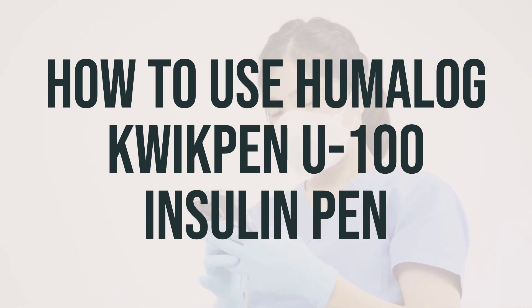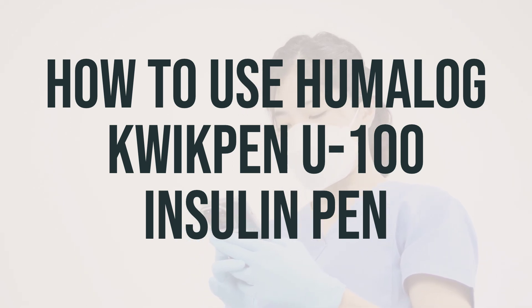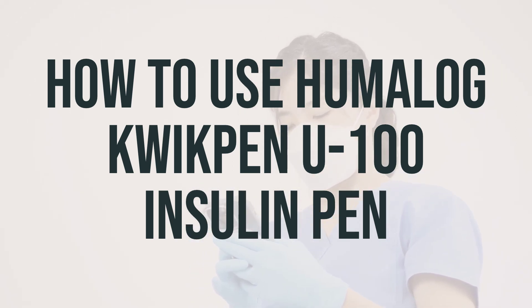Do not inject into skin that is red, swollen, itchy, or damaged. Inject this medication under the skin as directed by your doctor, usually within 15 minutes before eating a meal or immediately after a meal. Do not inject into a vein or muscle, as this may lead to very low blood sugar. Always measure each dose carefully, as even small changes in the amount of insulin may have a large effect on your blood sugar.